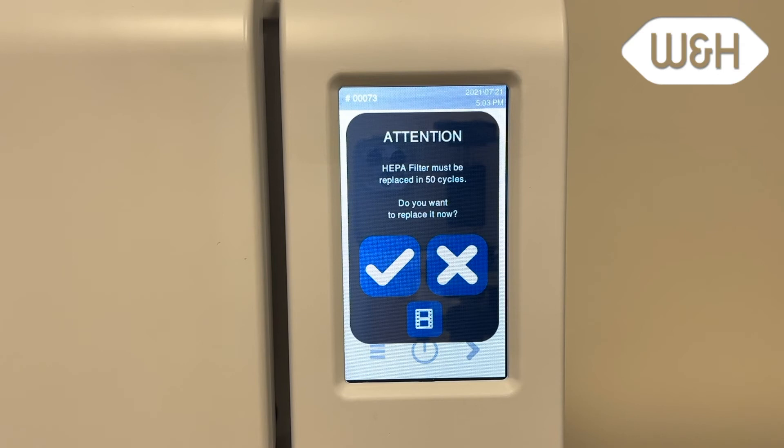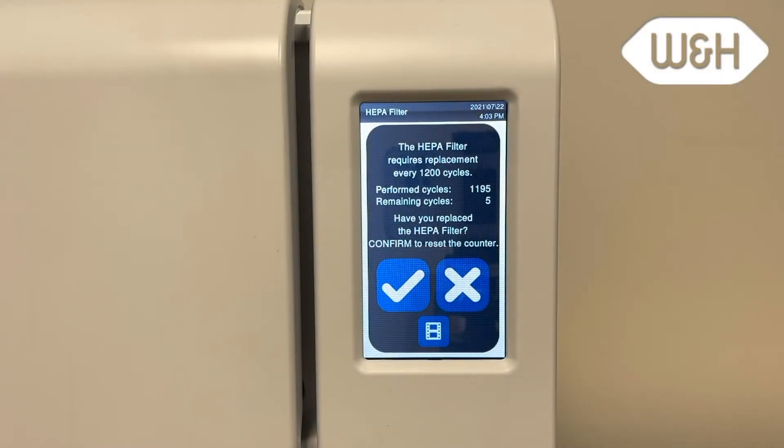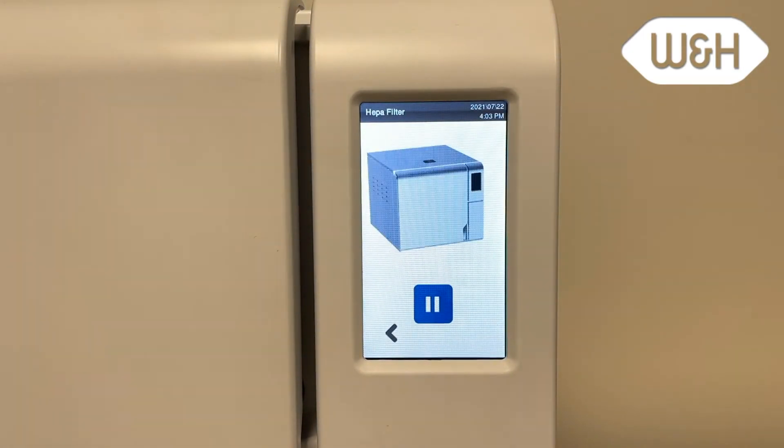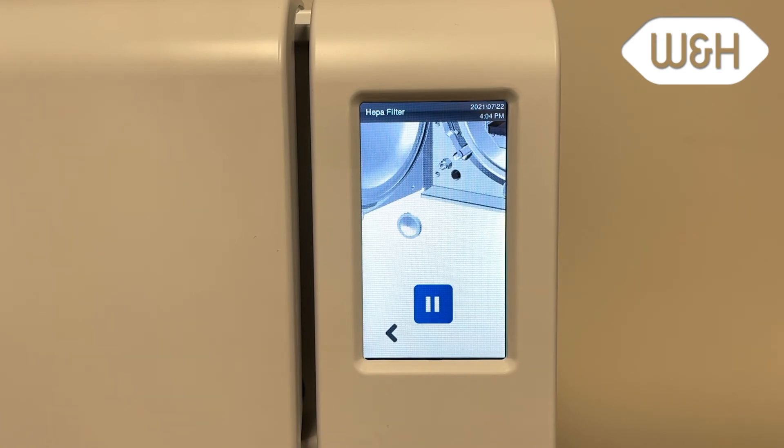Press X if you do not replace any consumable, or press checkmark if you replace the consumable immediately. Once the replacement message appears, it is time to replace the consumable. Press checkmark if you replace the consumable immediately, or press X if you do not — a reminder message will then appear in five cycles. Click on the movie icon to view a brief video on how to replace each consumable. Note that the part number for each consumable will appear to help in the reorder process.